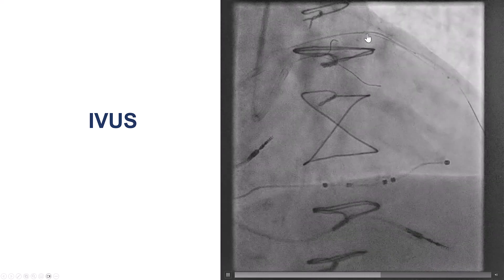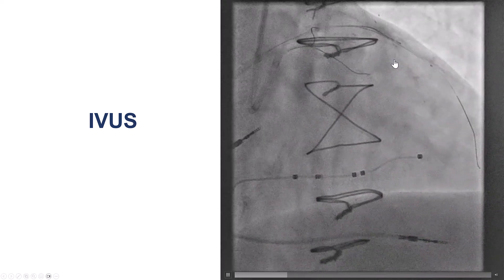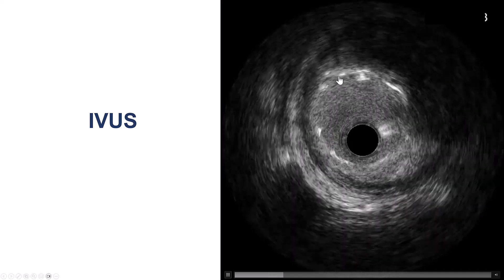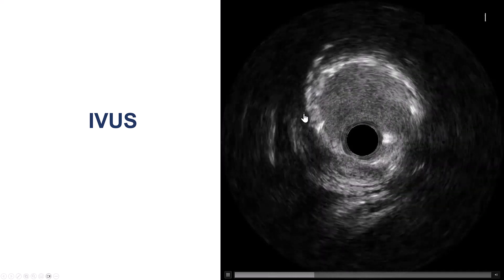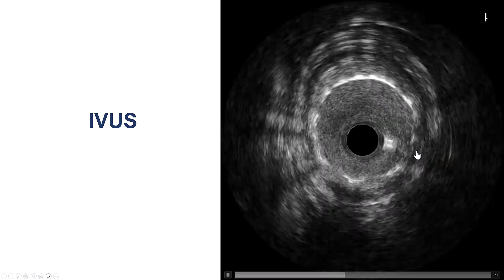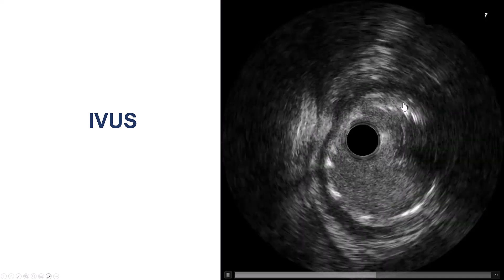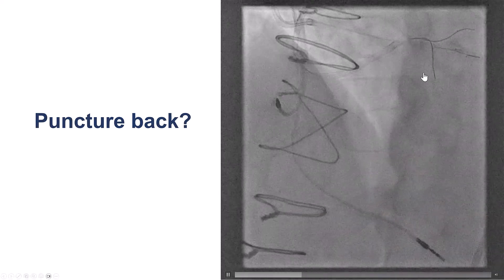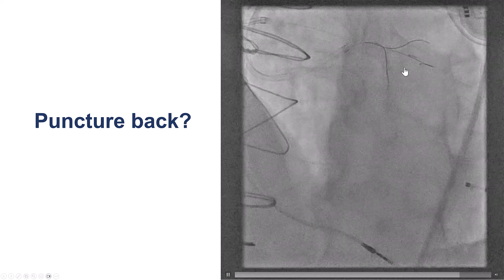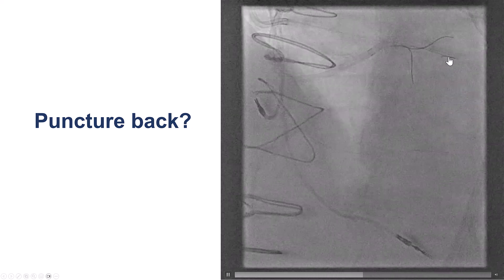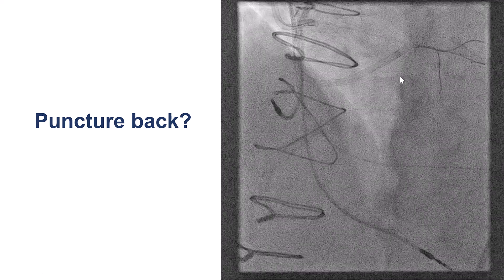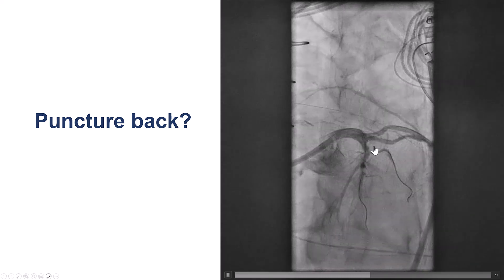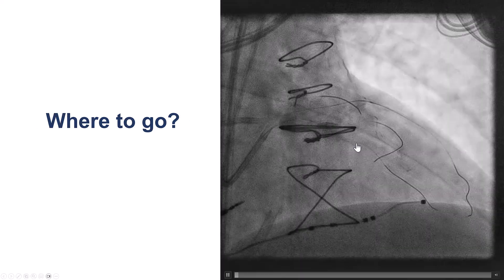We did IVUS into the saphenous vein graft, which didn't help much. We also did IVUS on the native coronary artery — on the LAD — but unfortunately there are previously placed stents, making it very hard to understand where the diagonal branch was coming off. This was not useful for planning to cross the native diagonal. We then used a dual-lumen microcatheter and tried to advance a retrograde wire where we thought the diagonal was. Searching on the native LAD was also unsuccessful.